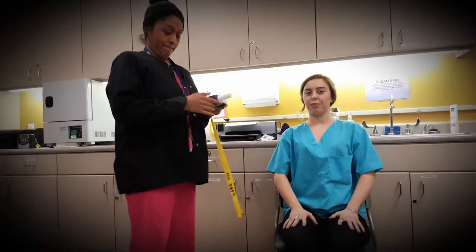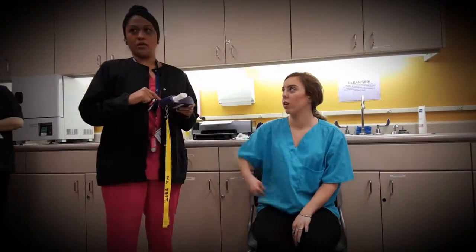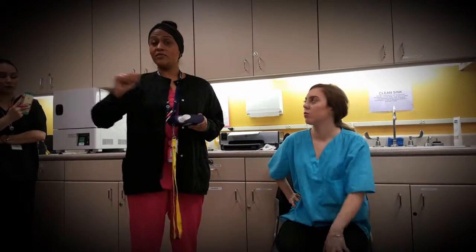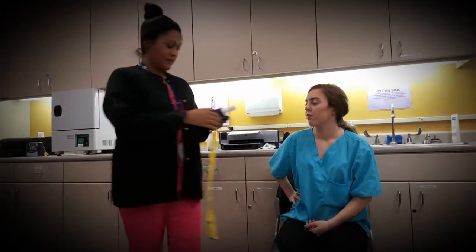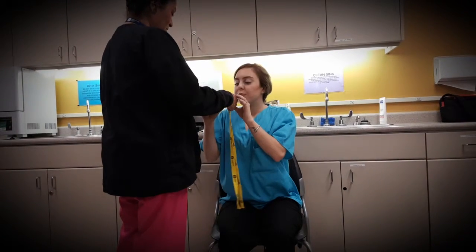The baseline isn't required for every patient — the machine determines when it's needed. If the test wasn't successful, the machine will tell you the patient needs to blow out longer and redo it. When practicing, we'll take what we get to avoid students passing out. But know that if the machine prompts it, the patient has to keep going. Some patients simply can't complete it, so you'd document that the patient could not complete the test or could not complete the second round of the FVC so the doctor understands.